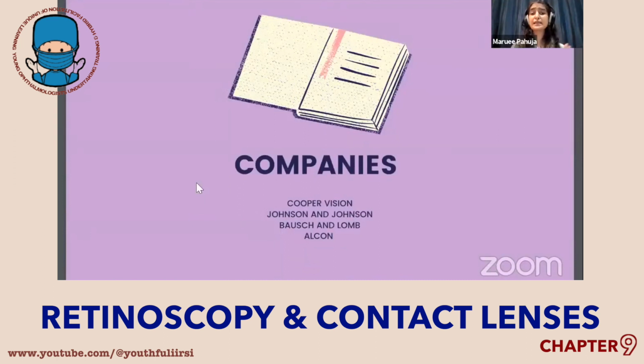There are different companies that provide different prescriptions, materials, and modalities of lenses. Some of them are listed here. There are many more. I have no financial interest, and each of these companies has a list of the different lenses that you can order from them, based on hydrogels, silicone hydrogels, daily disposables, monthly, quarterly, and yearly lenses. And based on your purpose and your prescription, you can decide which company's lenses you would like to order.